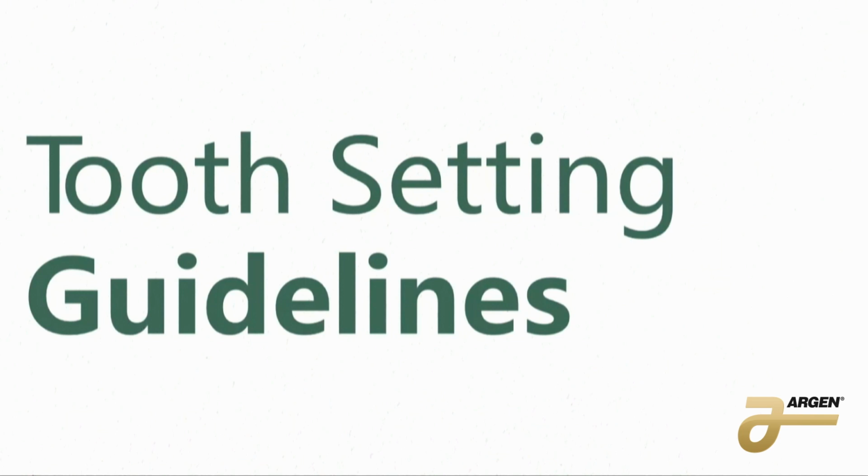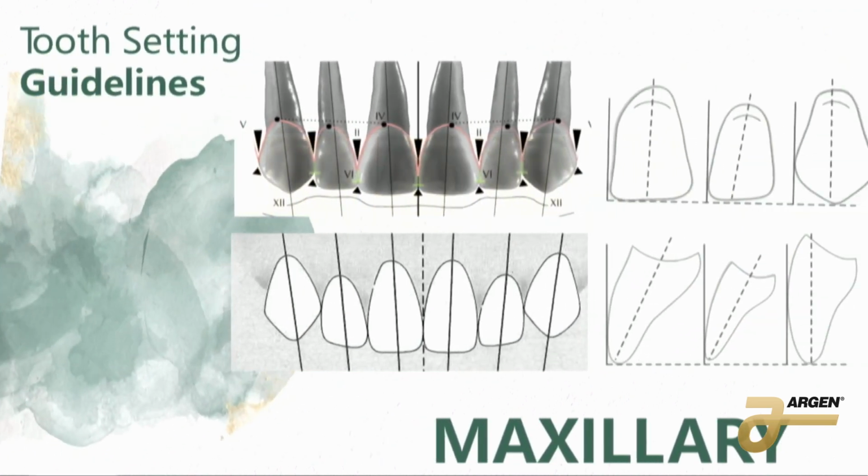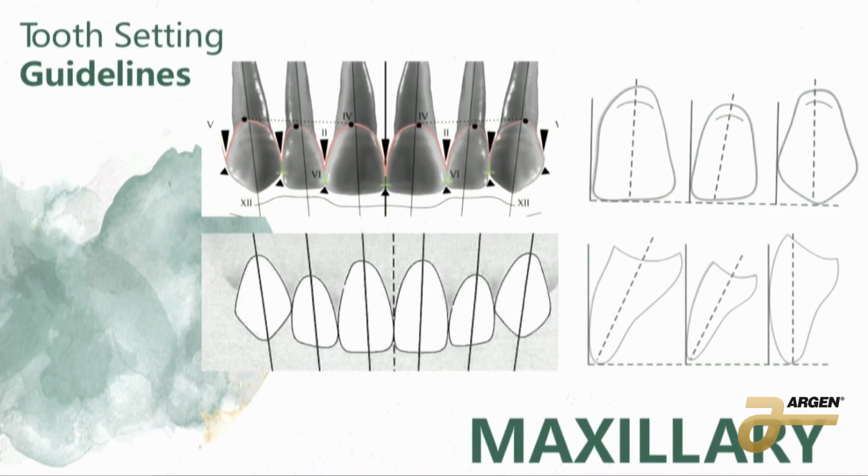We're not going to go super in depth in that. Like I said, we could go down a really big rabbit hole with occlusal schemes. So if you want to chat after, please come talk to me. But I will go over anterior, what we're seeing. Anteriorly, it's based on what teeth you're using, what molds you're using. Every company has its own little guide or textbook, but this is generally what we're seeing. You kind of want it fanned out. The nice thing about digital is these setups come in for you.